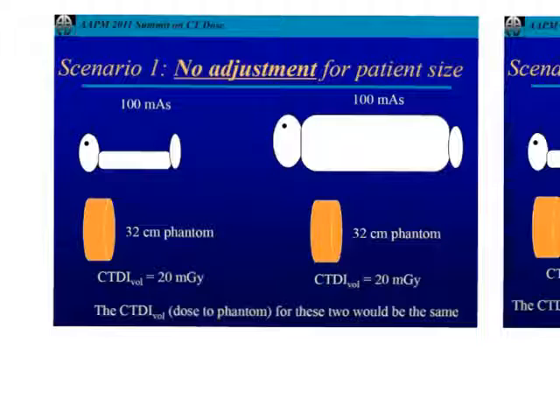Well, what phantom? And what's interesting is, depending on your manufacturer, it might change that phantom model out or not. Like GE, for example, changes the phantom model out if you're scanning at a smaller field of view. It'll go eventually to the smaller phantom size. But you can see in this scenario, there was no adjustment by the technologist for the patient's size, right? They did not adjust the technique.